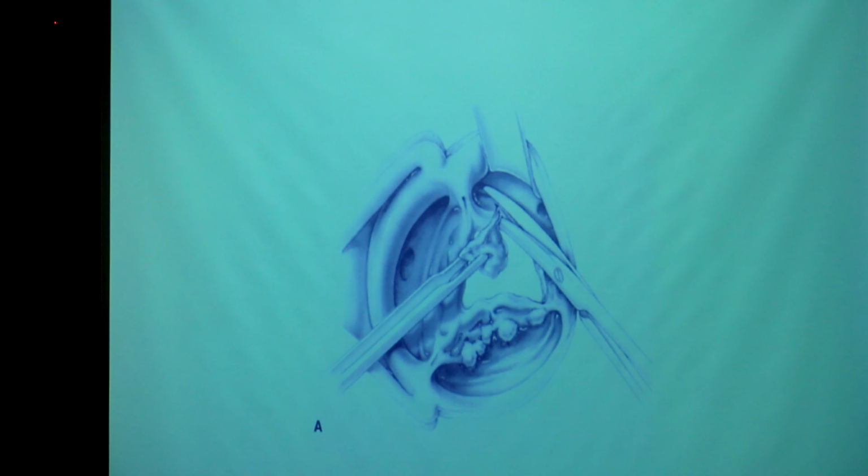Coming to the mode of decalcification, Kirklin says you need to start decalcification at the area just in the middle of the right coronary cusp, because this is the area which is comparatively free of calcification. You start here at the free edge and go towards the left coronary commissure. You end here. After that, you start from here and you go towards the non-coronary commissure and end here.